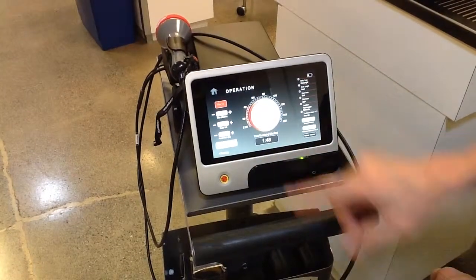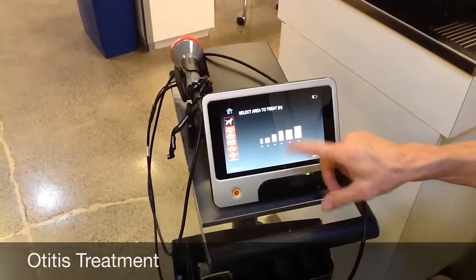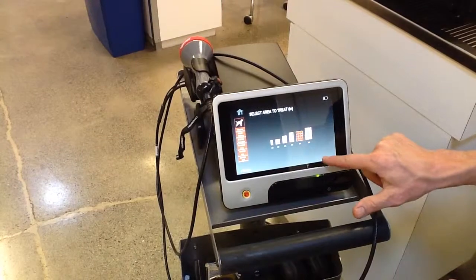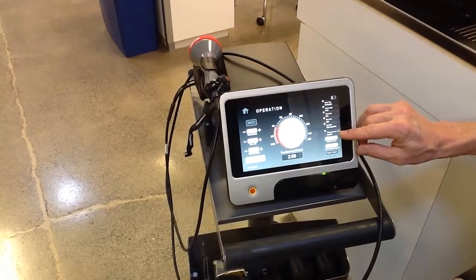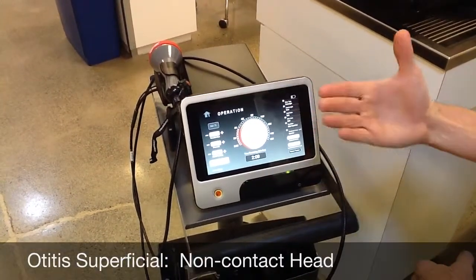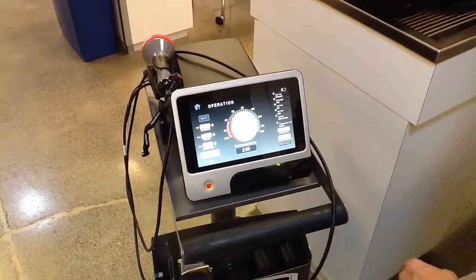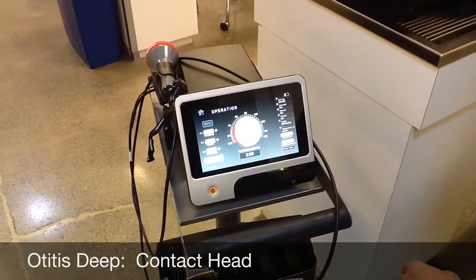You can hit the max button or adjust the dial up or down and your dose does not change. For otitis, it asks for the size of the pinna and external ear canal — always err on the side of slightly larger. This takes you through two treatment areas: first is otitis superficial, using the non-contact head; when done with area one, it tells you to go to area two. Many of these will be bilateral treatments, so you repeat for the other ear, switching treatment heads twice — from superficial to deep — each time.